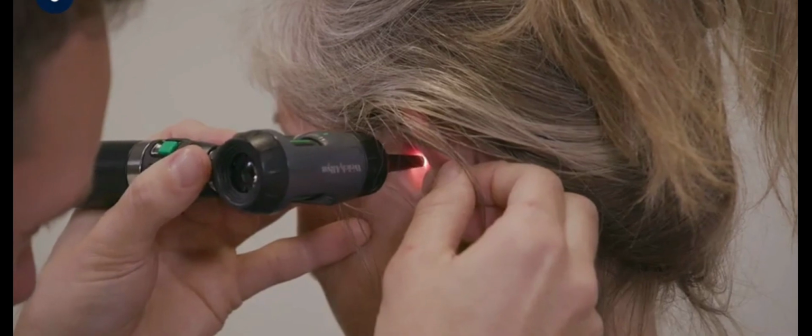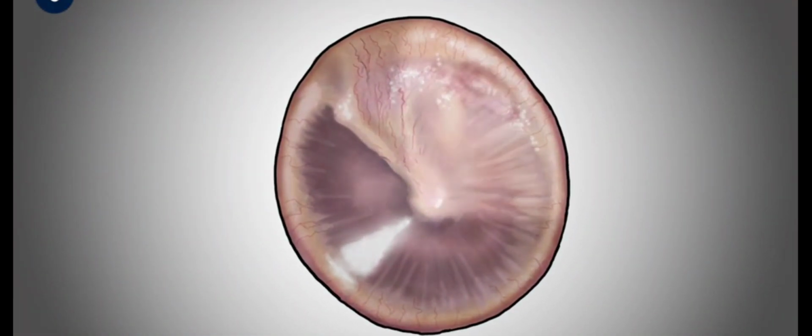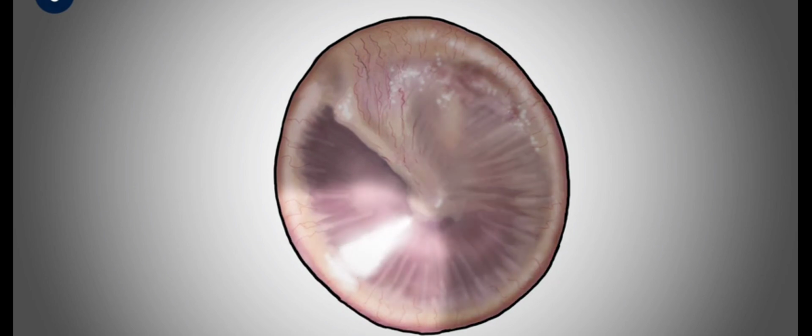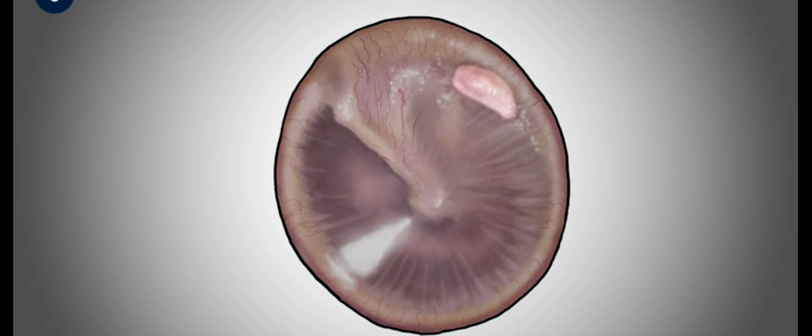Inspection of the tympanic membrane involves looking systematically across all four quadrants, noting the color, shape, any bulging or retraction, and any visible perforation or scarring of the membrane. A cholesteatoma classically causes a retraction pocket in the attic or posterior-superior quadrant of the tympanic membrane, sometimes appreciated as a pearly white lesion behind the membrane.